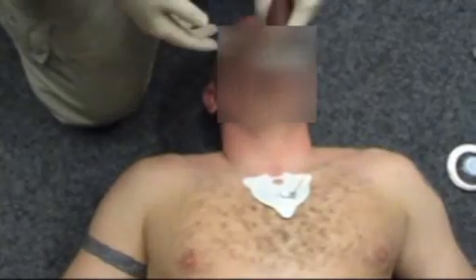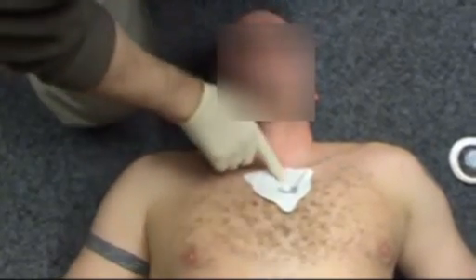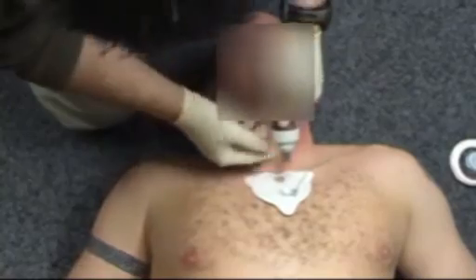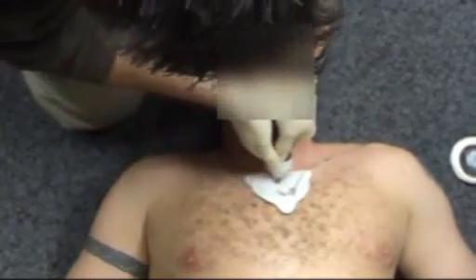So you're above the patient. I'm in an ideal position here because my hand is perpendicular in one line, so I can insert with the correct force from that. So we've got the place, we know we're in the right place. Offer it up, make sure it's in the hole. And one — easy.